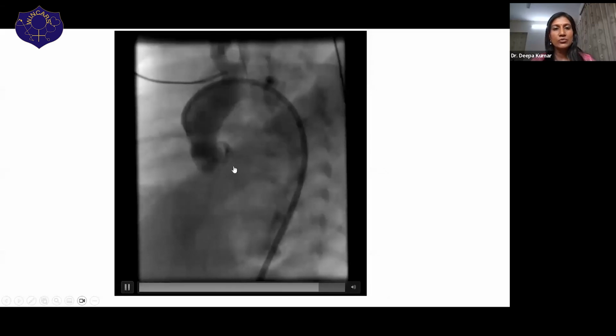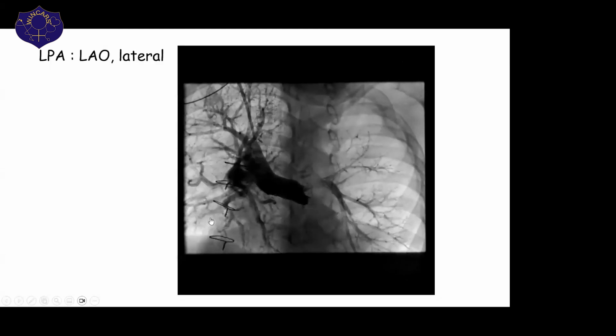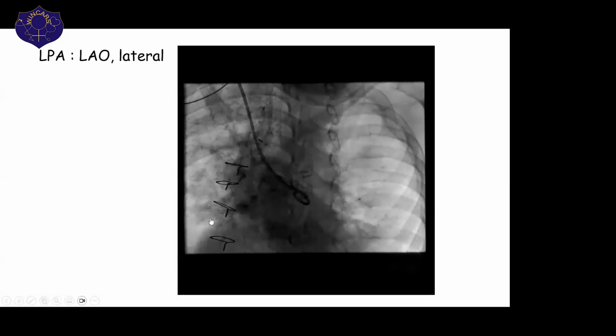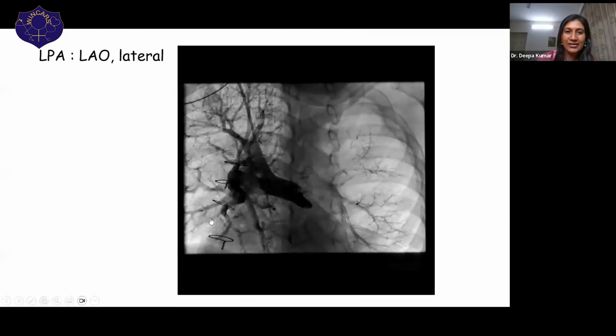And you can see 2 coronaries from 2 sinuses. And the aortic arch interruption, we can't expect it. The catheter has gone from below across to the arch of the aorta. Yes, we've gone retrograde.